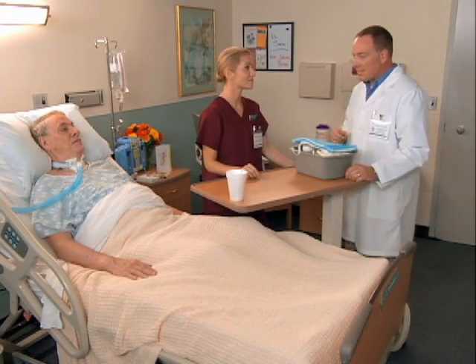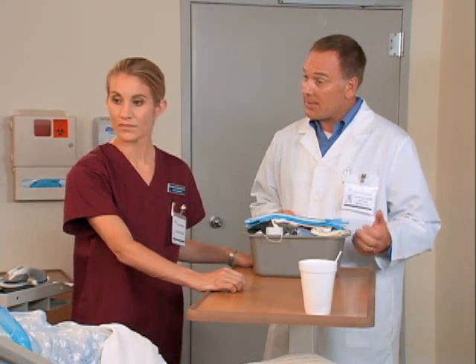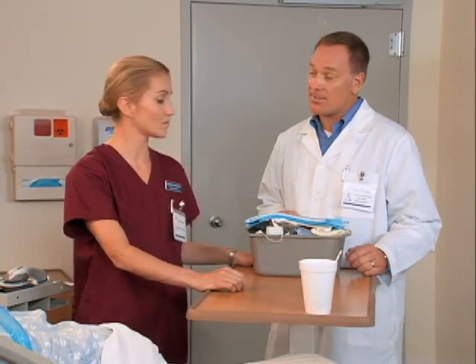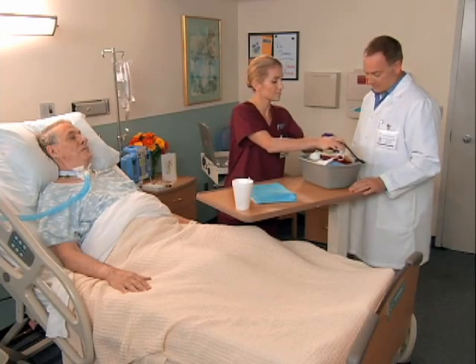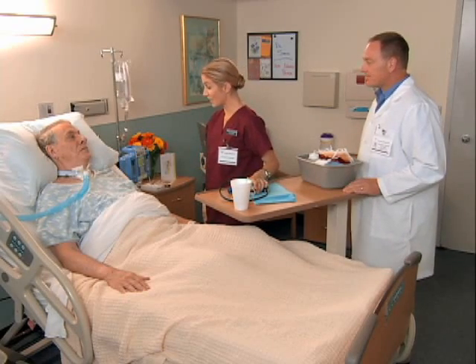I'd place the patient in the lateral position facing me instead of in semi-Fowler's position. Okay, good. Now, assess Mr. Marks' respiratory status, including his respiratory rate, oxygen saturation, and lung sounds. Okay, Mr. Marks, I'm going to listen to your chest, okay?